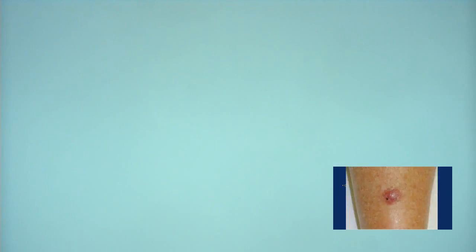So this would have just been a bump in the skin, maybe not even any color to it. And so basically, if you like new names, you can now call this a low-grade neuroendocrine tumor. I still like carcinoid. So the main thing here was that the stains were of interest. It was positive for some of the stains that we use for neuroendocrine differentiation, synaptophysin, chromogranin, etc.